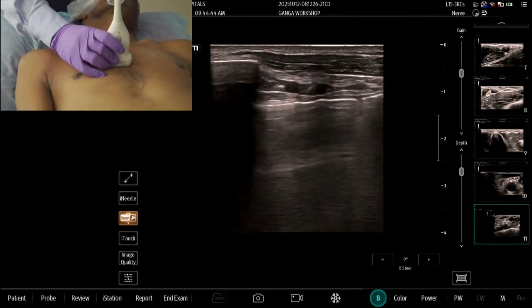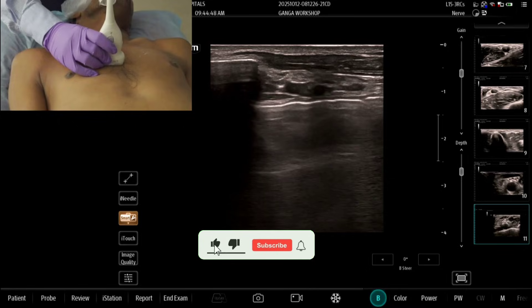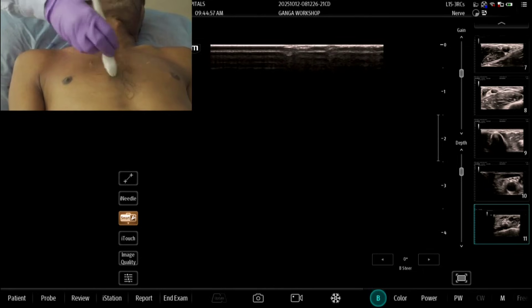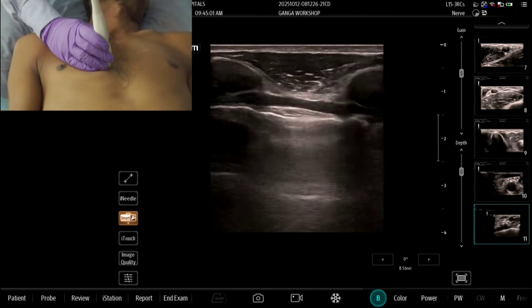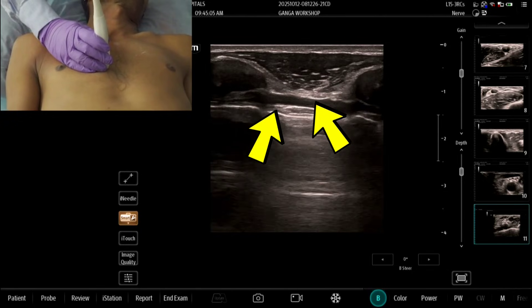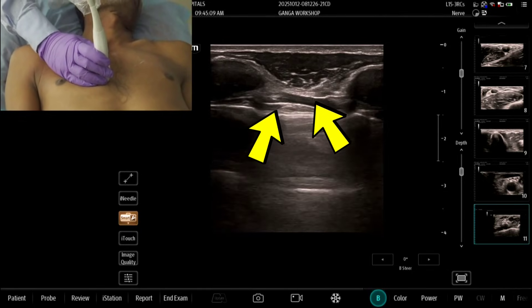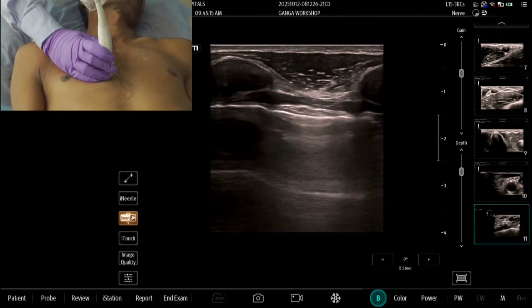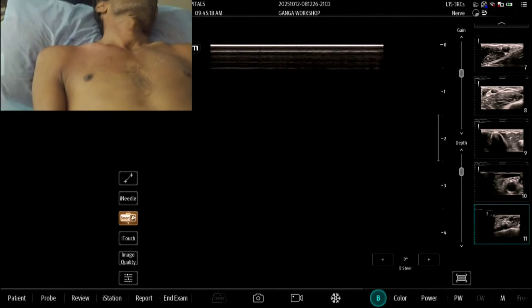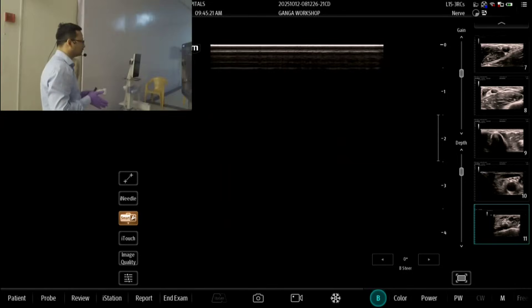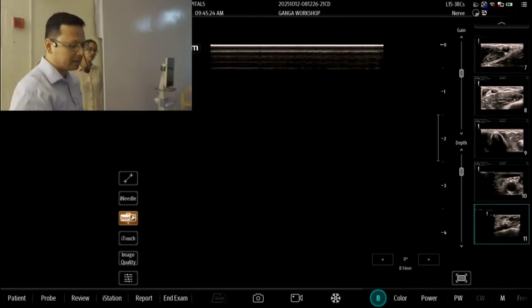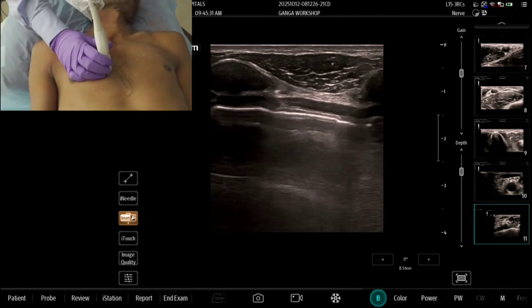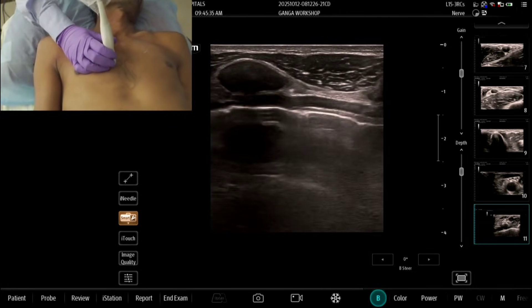Be careful — two problems: one is vascular injury and the other is pleural puncture. It is very close to the pleura. In the longitudinal or sagittal scan, the problem is when you go laterally, you can see a hypoechoic structure that could be a muscle or a vessel and you cannot differentiate. Put on color to differentiate. The vessels are traveling parallel to the sternum, so in sagittal scanning we might miss the vessel, creating a possibility of vascular injection or vascular puncture. This entire structure could be a vein or artery — pulsatile means artery.